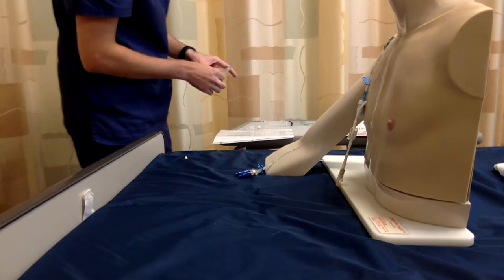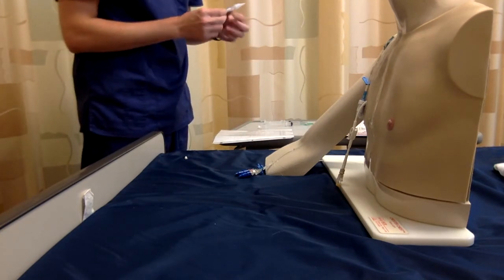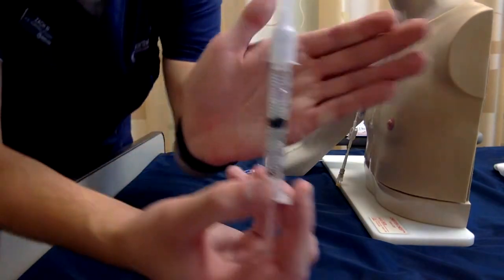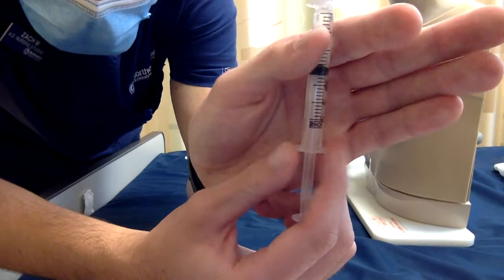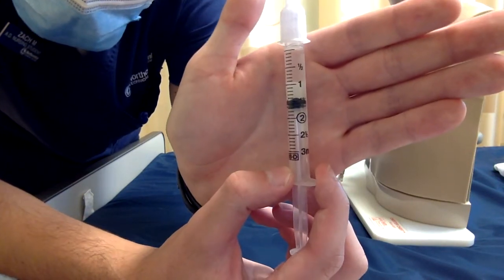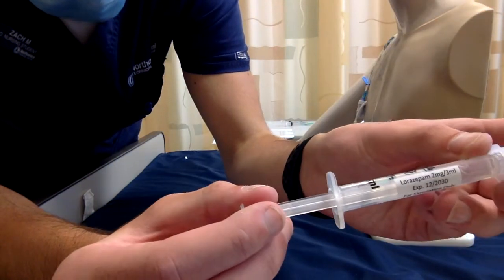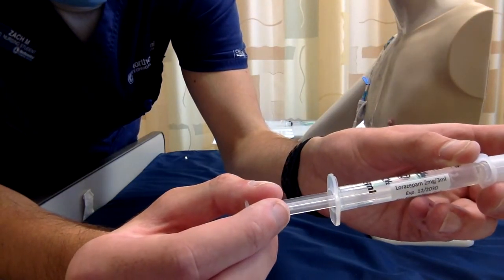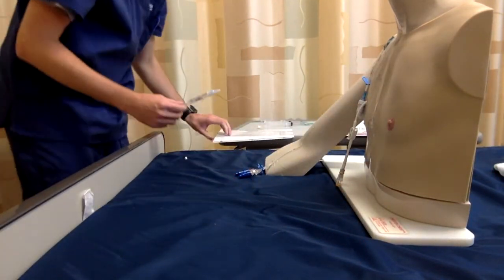Oh, I'm also going to check if he has any allergies, which he doesn't. Okay, so now I have, it's kind of hard to see, but 1.5 of the 2 milligrams in 3 mils, and he's going to be getting 1 milligram. So now I'm going to be doing my 5 rights 3 times.